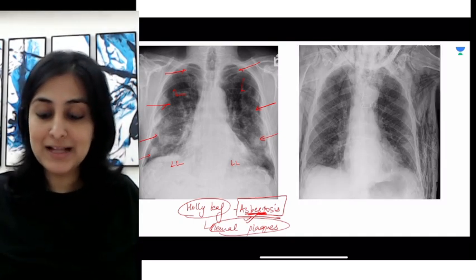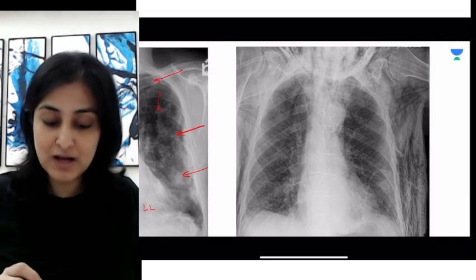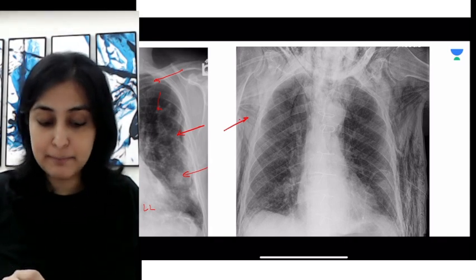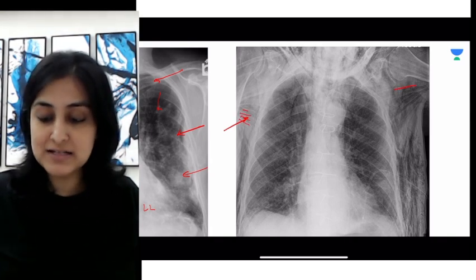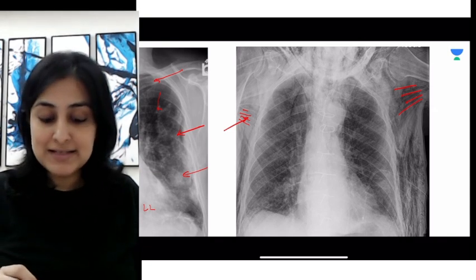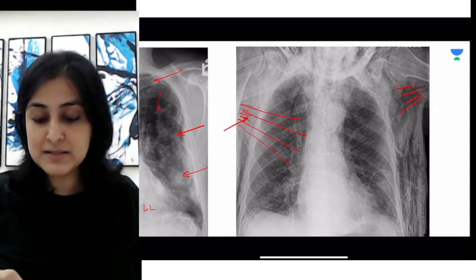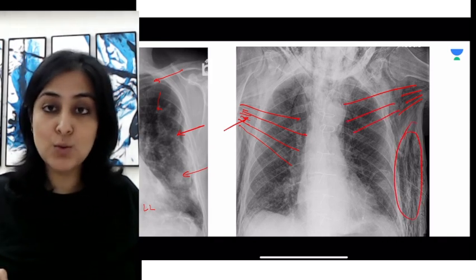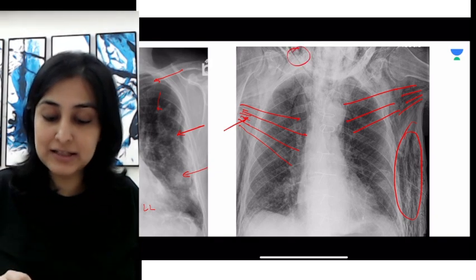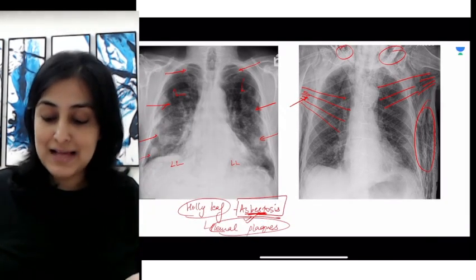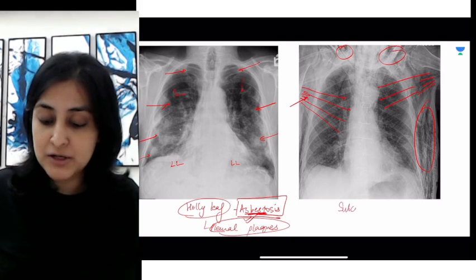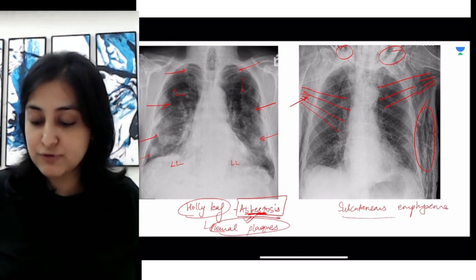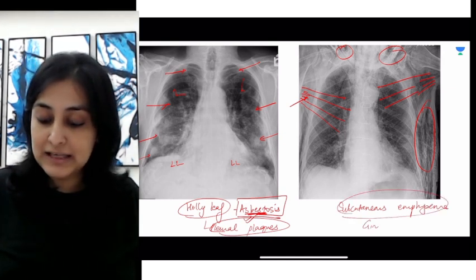In contrast, when we look at this particular radiograph, you can notice how instead of white opacities as seen with the holly leaf sign in asbestosis, these are black linear opacities — nothing but air. Air is radiating in a pattern along the pectoralis muscle. Apart from that, along the lateral chest wall in the subcutaneous plane and in the neck, you can also see air. This represents subcutaneous emphysema, and the leaf sign described for this is called the ginkgo leaf sign.